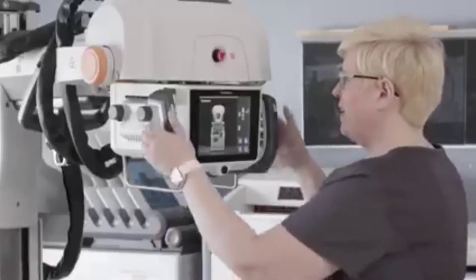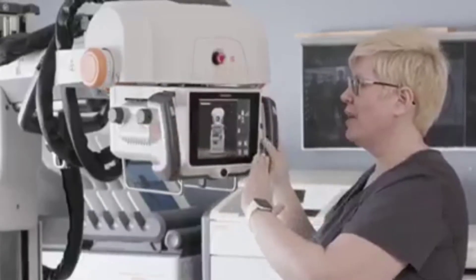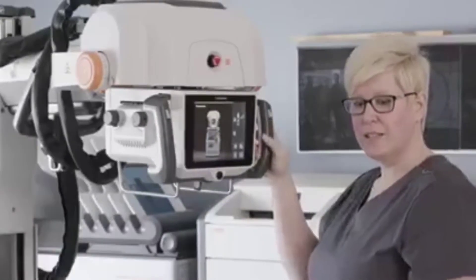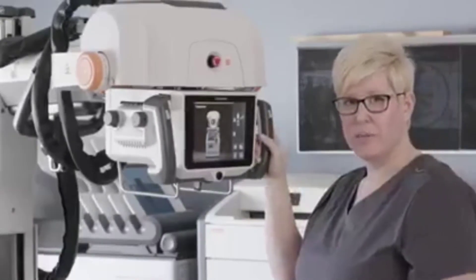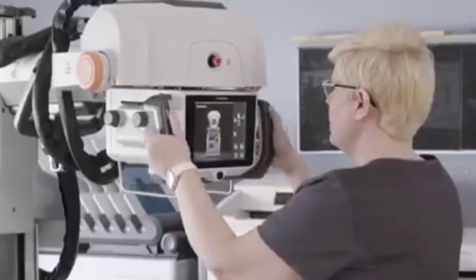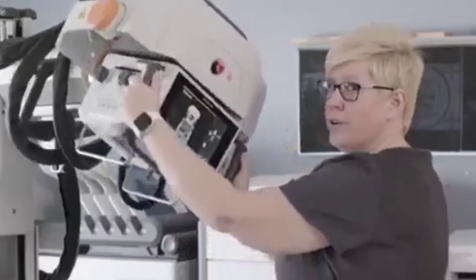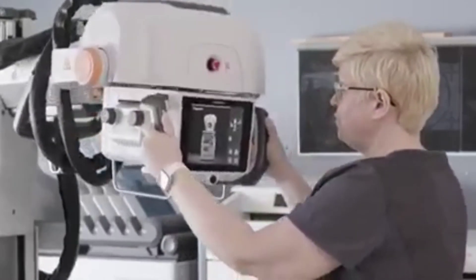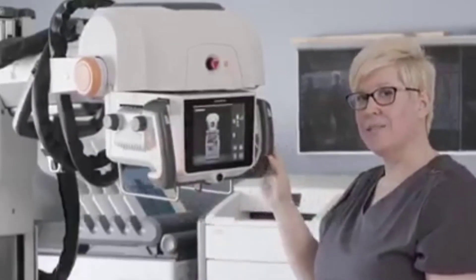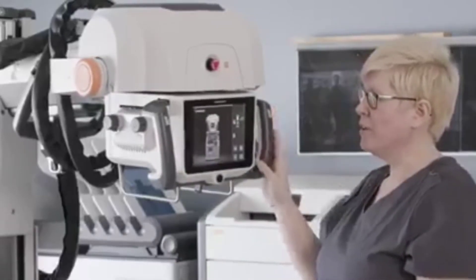The tube head on the DRX Revolution mobile system has been redesigned. The overall weight and size has been reduced, making this much easier to maneuver in tight situations such as a patient incubator in the neonatal intensive care unit. We've also increased the range of motion, specifically in the back and forth motion of the tube. And we've added detents to allow the technologist to have some tactile feedback when positioning the tube for their exam.